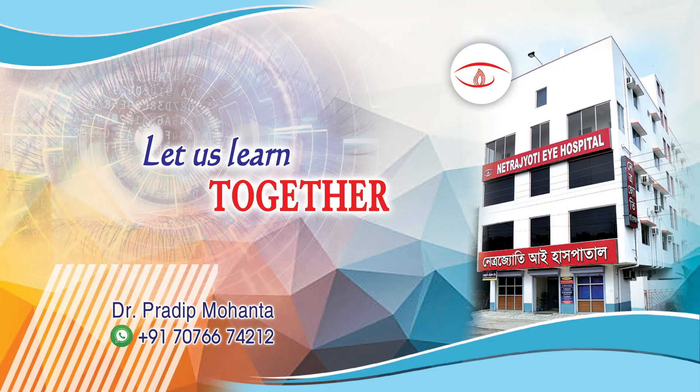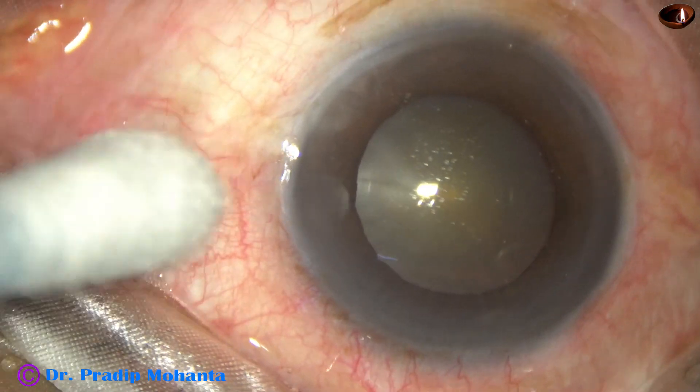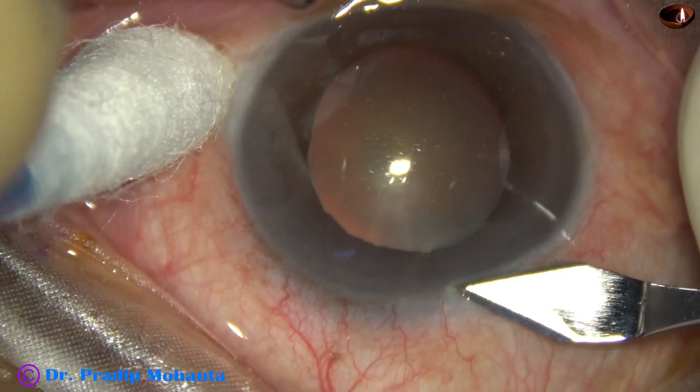Friends, welcome to my workplace at Ranagha, West Bengal, India. This is a cataract with IFIS, Intraoperative Floppy Iris Syndrome. Let us observe this surgery.